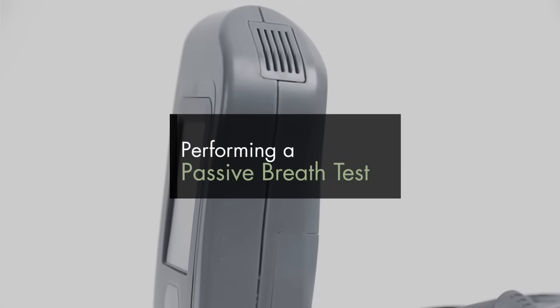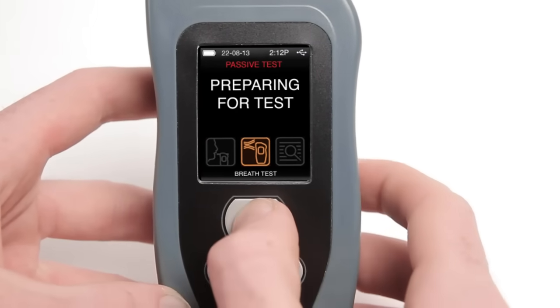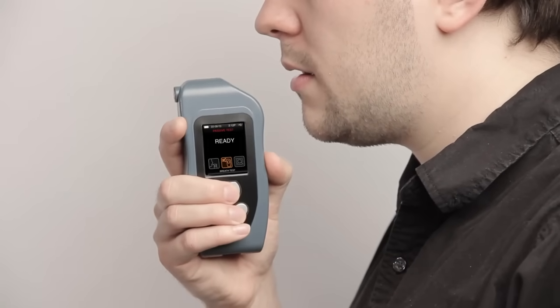Performing a Passive Breath Test. Select the Passive Test icon to perform a breath test without the use of a mouthpiece. Preparing for test is displayed, followed by Ready. Position your mouth 3 cm away from the exhaust grid and exhale for 5 seconds.